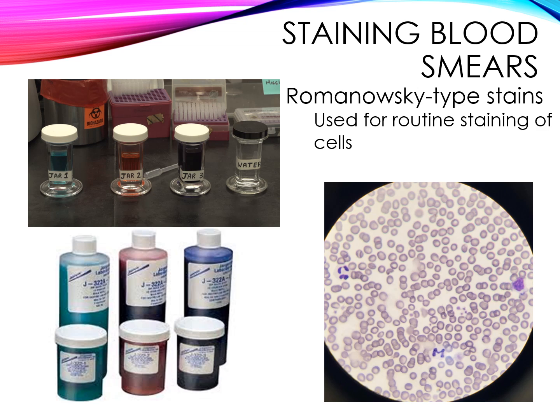And below you can see a blood smear, and you can see that the red blood cells are picking up the red dye or stain, and the purplish or blue white blood cell nuclei are being picked up as well. So you can see there's two neutrophils here where we are staining purple their nuclei, and then the nucleus of the lymphocyte in the right hand corner is also picking up the blue dye.